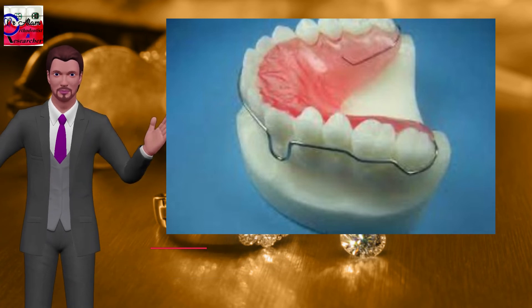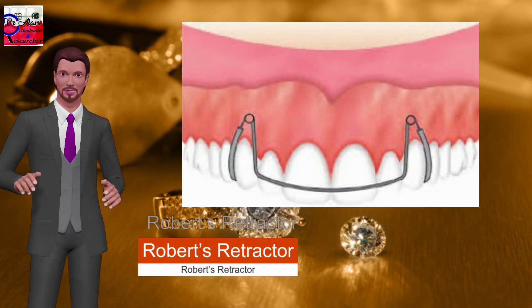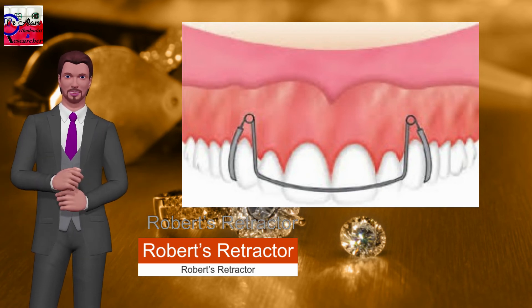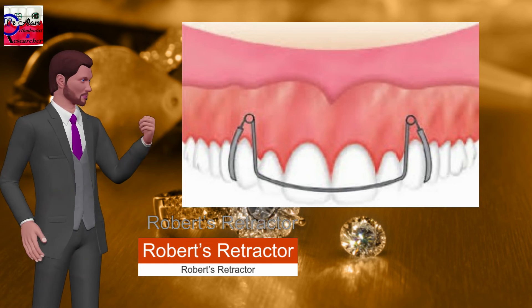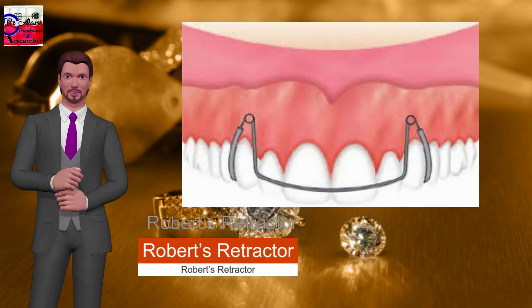Roberts retractor: designed by G.H. Roberts. Used for retraction of four incisors in cases of severe anterior proclination with more than 4 mm overjet. It is an excellent retraction bow. Activation is done by adjusting the bow by bending the vertical limb below the coil.